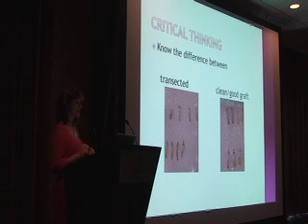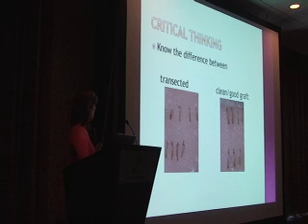I also take pictures of bad grafts or ugly grafts so the person can develop the awareness of what not to do by comparing. So on the left hand side you're going to see the grafts that are not good, and so this is cut too short, there's a transected hair, this then doesn't have a hair bulb, so it should be trimmed. This one doesn't have a hair bulb. So all these grafts, for example, these two are all transected, there is no hair bulb, so there's no purpose of transplanting this piece of tissue because it won't grow. And so the idea is to take grafts that don't look good compared to the grafts that look good so the person can start developing critical judgment.